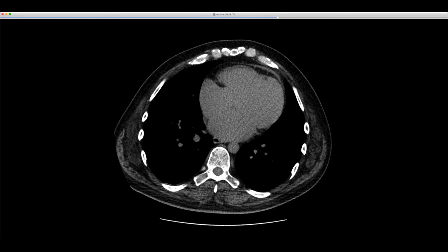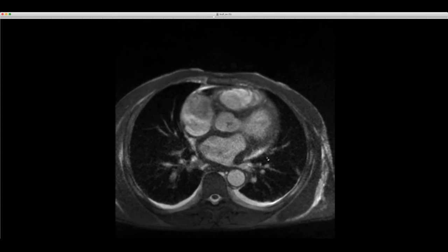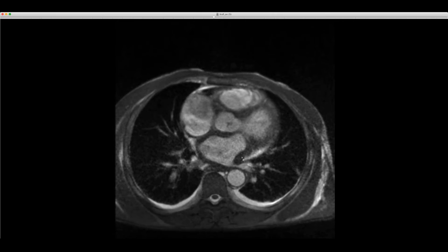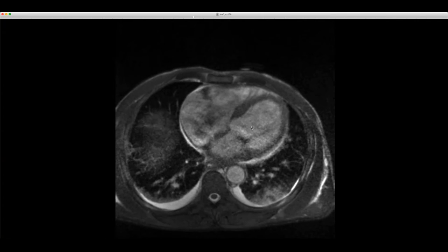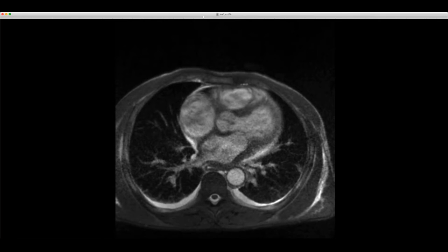Let me go on to this next case. This is a really interesting case courtesy of Dr. Stillman. Looking at the SSFP sequence, you can see the abnormality — there are pleural effusions here, but the dramatic thing is that the left atrium is very, very thick, much thicker than normal. You can see the normal right atrium right there for comparison. The myocardium of the left ventricle is not all that thick. So there is dramatic thickening of the left atrium.